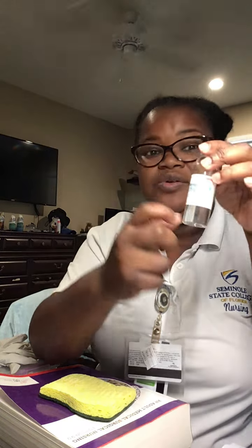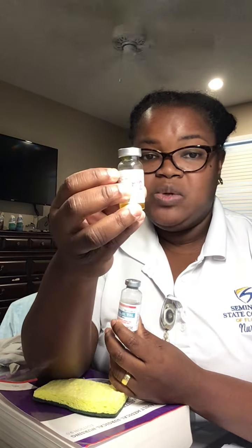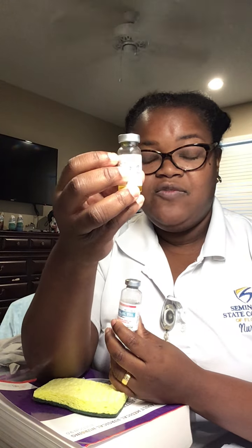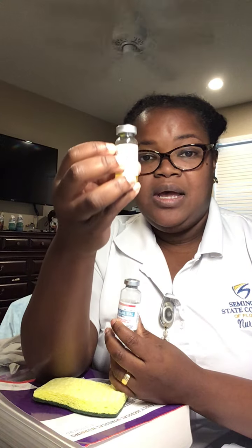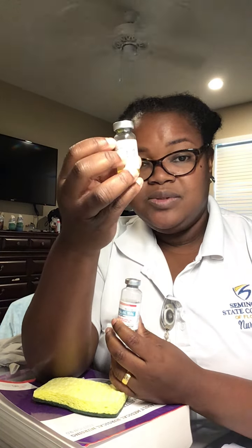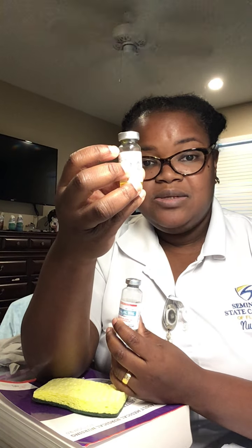Okay, I'm going to do my second check with my medicines. Here we go. I have Anna Pawlowski for both of them. For the SubQ route, I have B12. I'm going to give 0.5 ml. The route is subcutaneous, and the time is 1600.